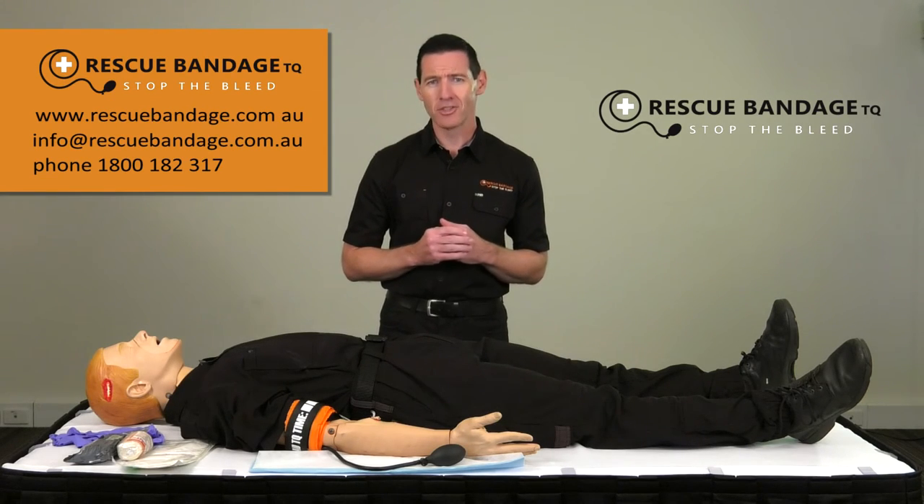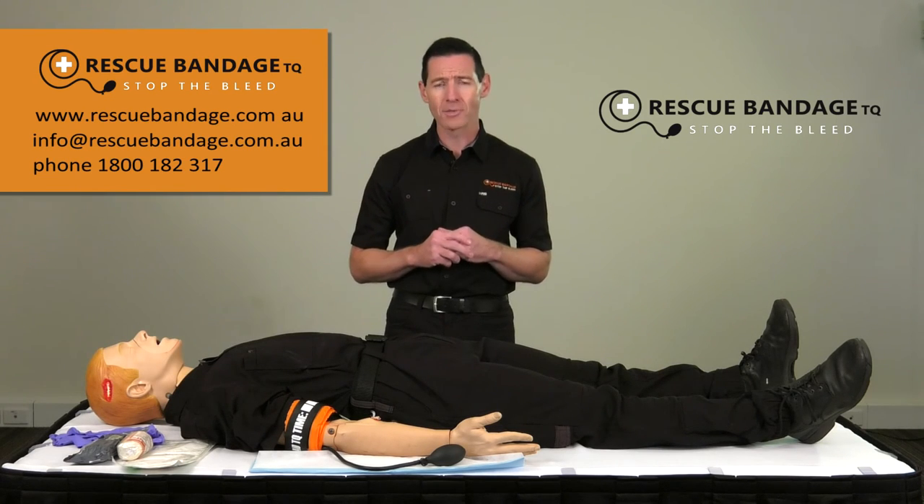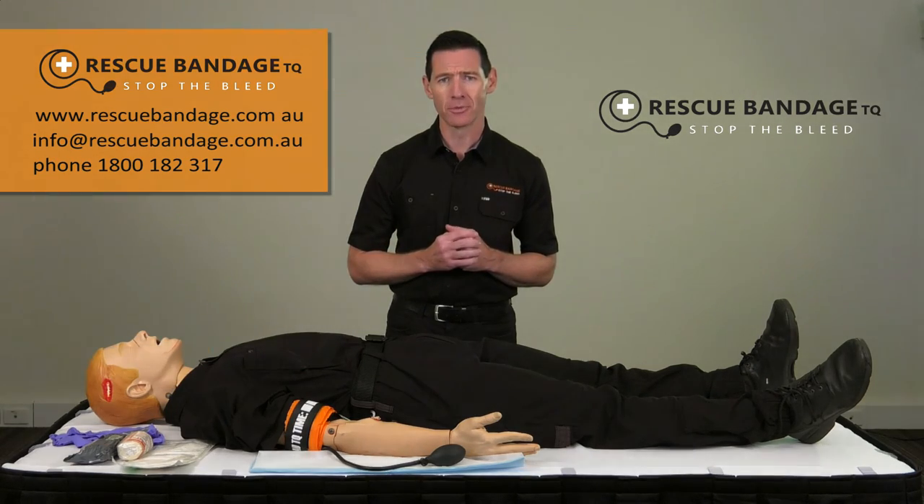Remember, the rescue bandage is just one part of the overall management of serious bleeding. Always make sure that you call emergency services and reassure the casualty and those assisting you.